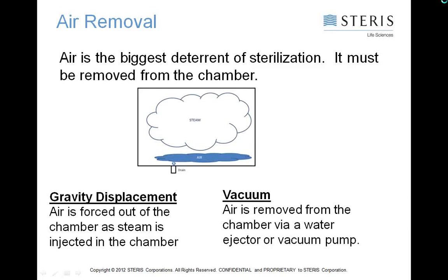We want to understand that, because we could have two potential problems. They're relatively rare. Don't see them a whole lot, but they can be problems. The first, on one side of the scale, would be wet steam. The problem with wet steam is it has a lot of water. And as we talked about, the amount of energy contained in steam is much higher than the energy contained in water. So what we lose with a wet steam is a diminished amount of energy.